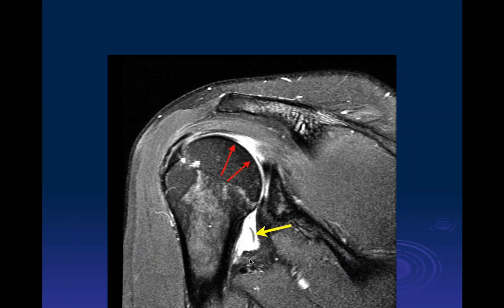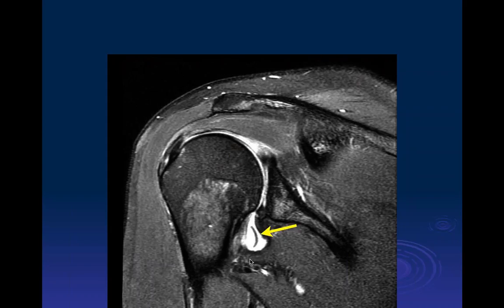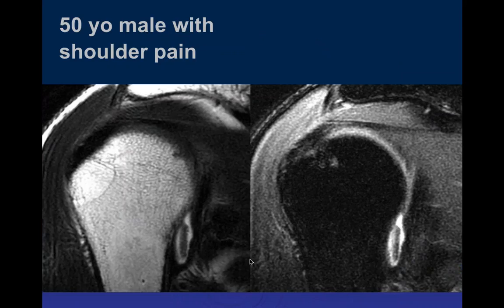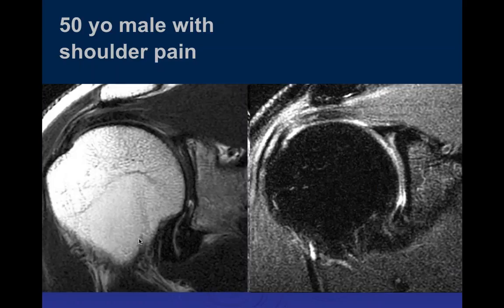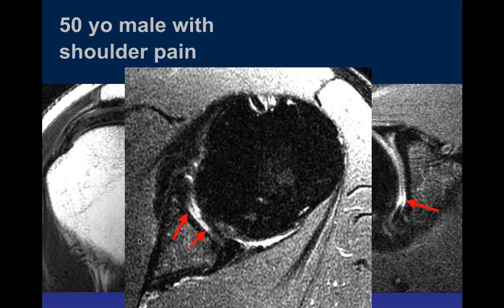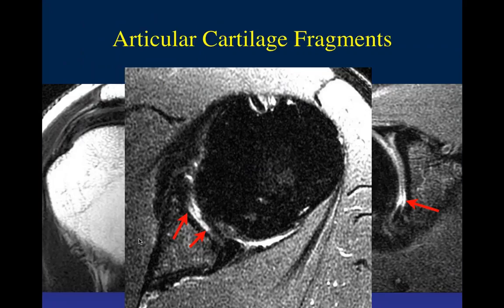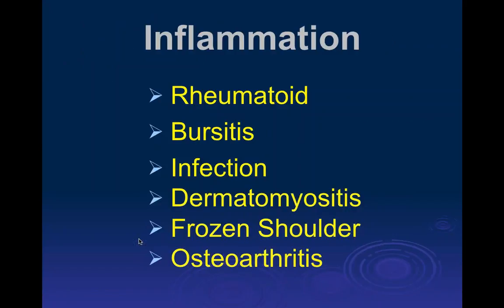In this 50-year-old male with shoulder pain, coronal T2 and PD fat-sat images show a linear hypointense structure that could be a fragment of articular cartilage or a loose body — possibly multiple fragments. This is likely a cartilaginous loose body, with the donor site visible on the humeral head.